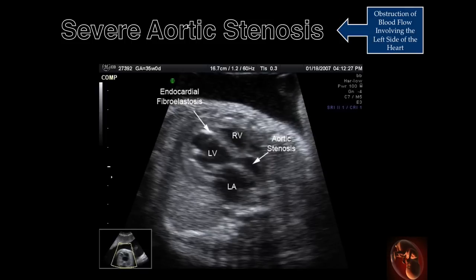This is an example of severe aortic stenosis resulting in endocardial fibroelastosis. Endocardial fibroelastosis may not be obvious from the still frame image. A cine of the contracting heart reveals this pathology more clearly.